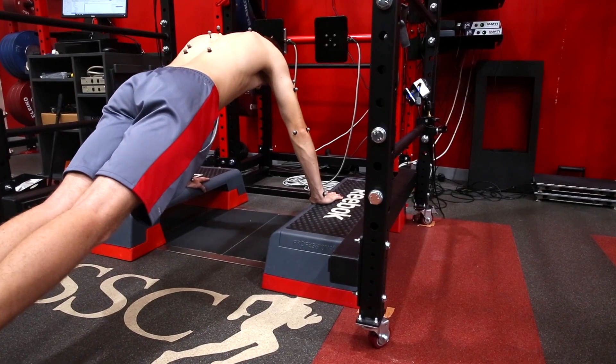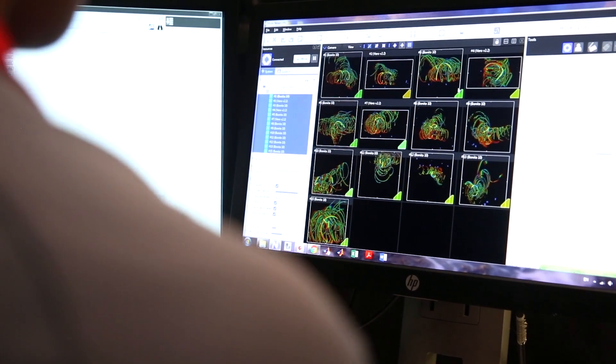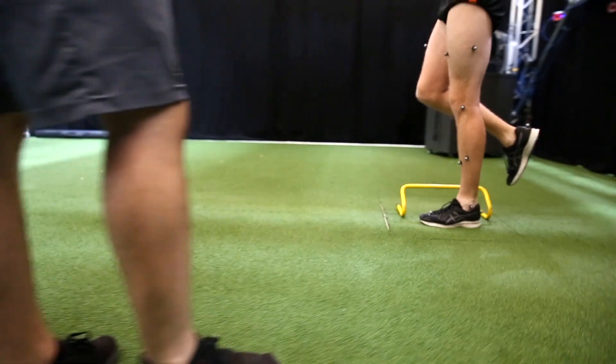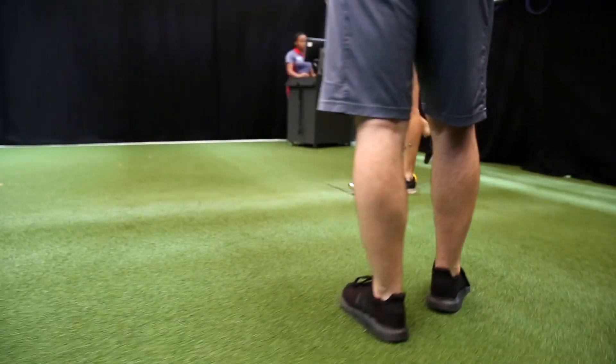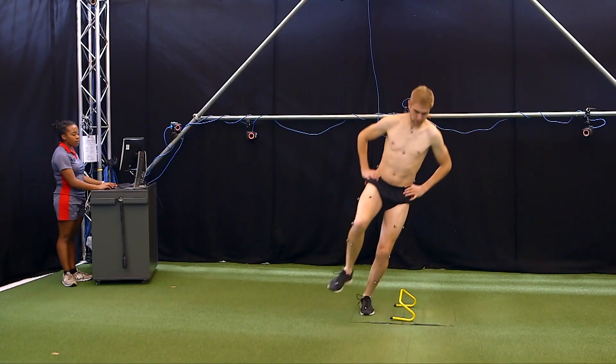We use 3D biomechanics to capture movement in an injured state and then subsequently through rehabilitation in an uninjured state. We can start to use that technology to fine-tune the rehab process.